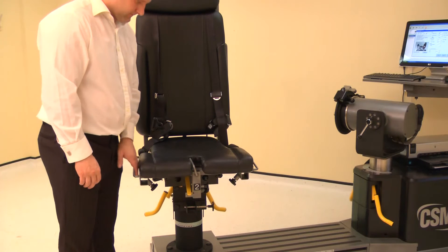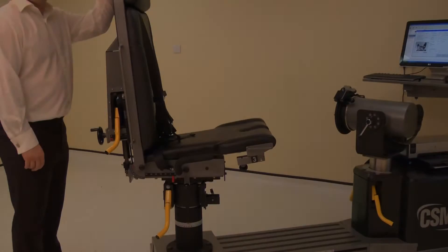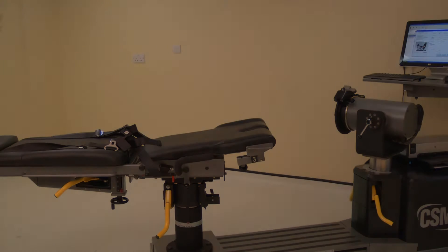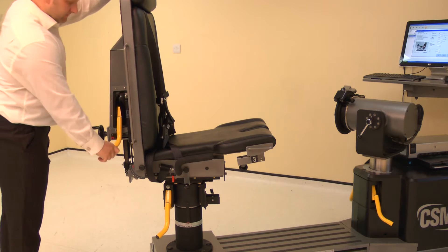Set the seat to the up position by lifting and releasing. To set the chair back angle, lift the locking handle and adjust the chair back to 68 degrees. Ensure both locking handles are pushed down to secure.